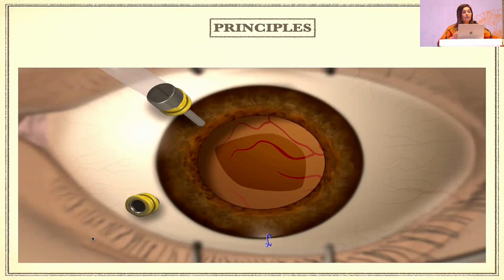But the concept of doing a pars plana vitrectomy, as Dr. Shell and as Dr. Lalit Verma have also highlighted, is a very important aspect. Now, what I have seen practically is that most of the anterior segment surgeons have an inhibition to put a trocar cannula into the system at about 3 to 3.5 millimeters from the limbus. Believe me, it is one of the most simple things that you can do, provided you follow the method of how to do that, and maybe any of your VR friends can help you with that. So that's one thing which can be very handy.